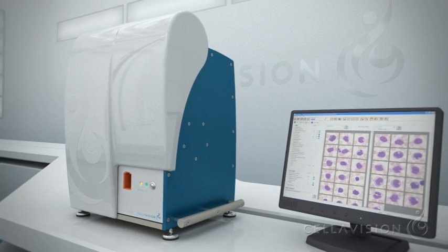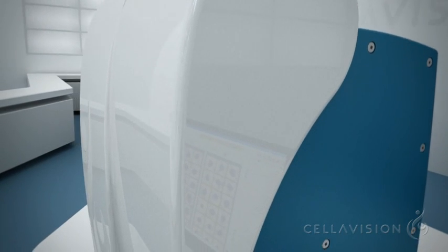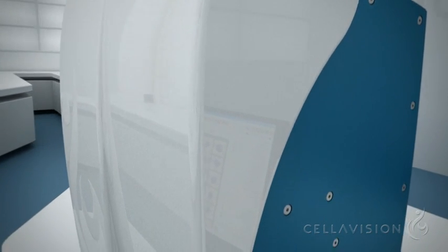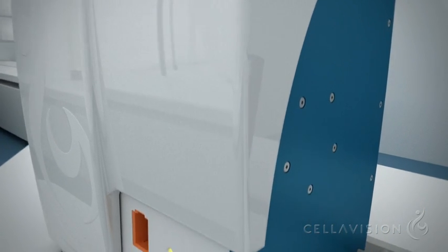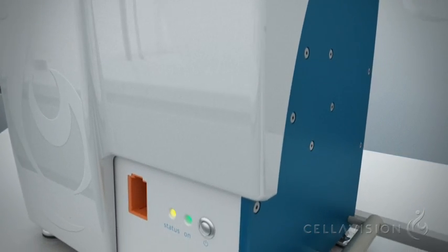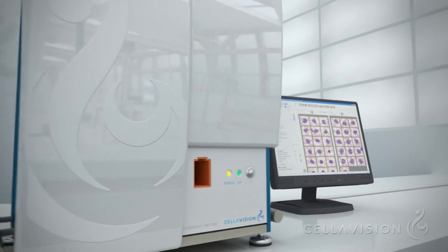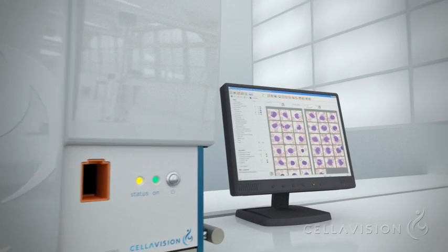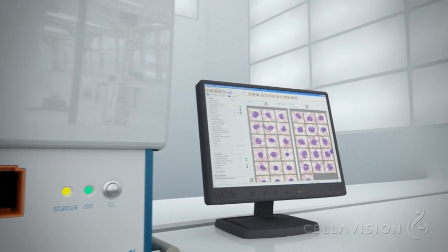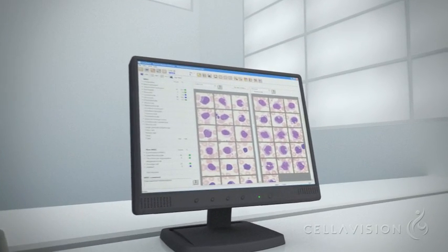With the Cellavision products, you open up new avenues of handling manual differentials traditionally performed in microscopes. This significantly reduces time and resources without jeopardizing quality.